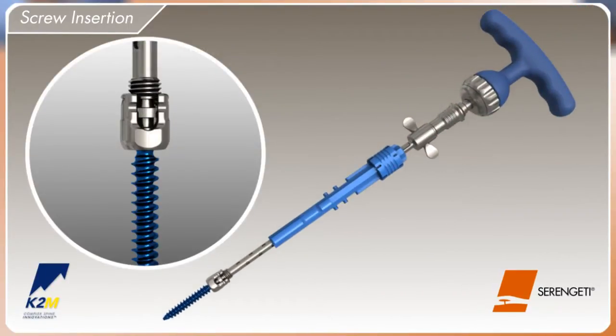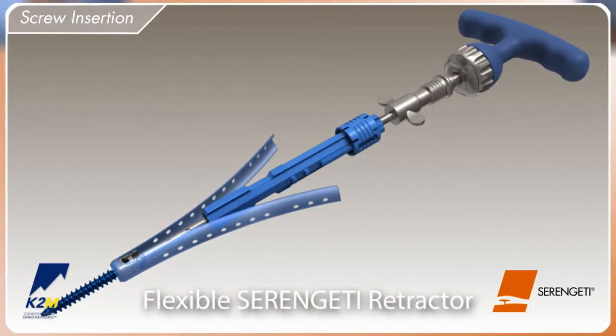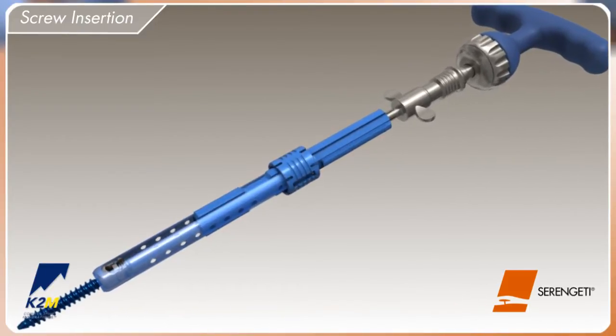The polyaxial screw is partially threaded onto the inserter and placed into the screw alignment guide. Fully tighten the Serengeti screw inserter to ensure co-linear alignment. The Serengeti retractor is slipped over the screw and attached to the pegs on the blue anti-rotation sleeve, and the locking ring is pushed down.